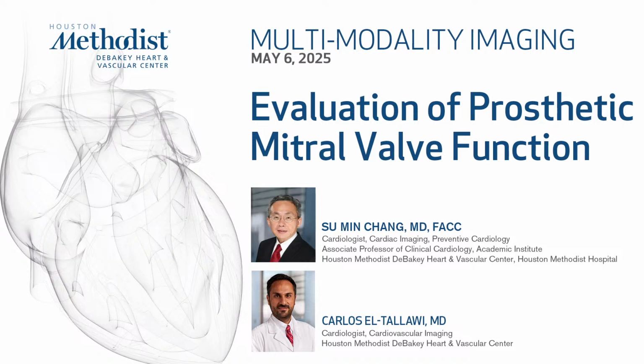This will be a continuation of the session from last week where the assessment of prosthetic aortic valve was presented, and the session was split into the assessment on echo and then the assessment using CT. Today is the same thing, but we're shifting to the mitral valve. I'm going to be presenting the echo assessment of prosthetic mitral valve dysfunction, regurgitation, and stenosis, and Dr. Chang will be presenting the CT assessment.